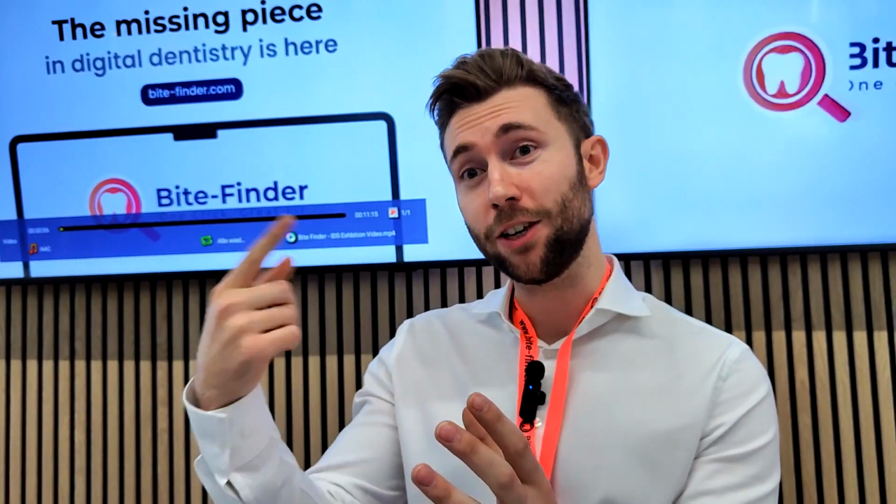Does it take a long time? Like you should leave those files overnight or something like that? No. Depending on your internet connection, the amount of features you want and how big the files are, 20 to 60 seconds. Okay. So all those calculations are almost instant? Almost instantly, yes. We also have a feature of serial computation, so you can click on one folder, and if there are 10 cases in one folder, it will be automatically queued and calculated one by one.